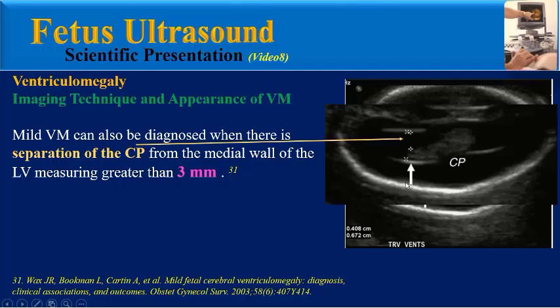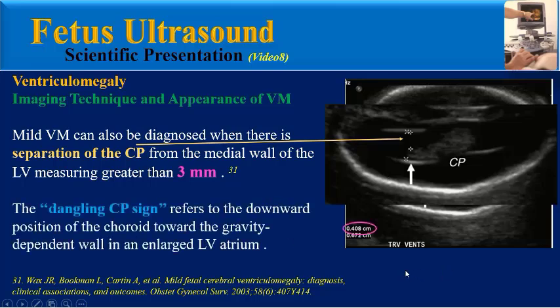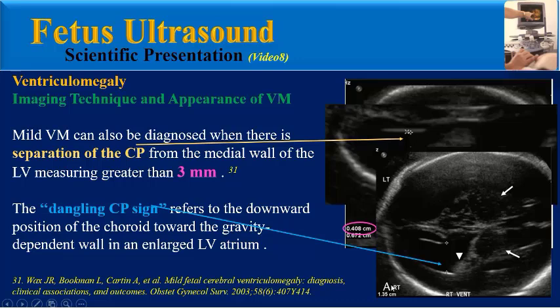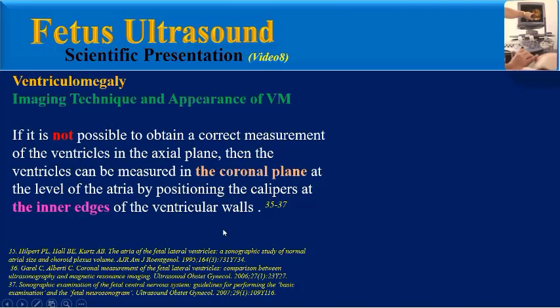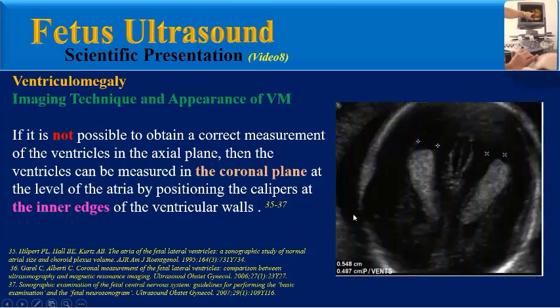To decrease possible technical deficiencies, the axial view should be strictly assessed by confirming that the proximal and distal calvarial margins are equidistant. Anterior landmarks include the cavum septi pellucidi, and posterior landmarks the fluid-filled V-shape of the ambient cistern. Ventriculomegaly can also be diagnosed when there is separation of the choroid plexus from the medial wall of the lateral ventricle measuring greater than 3 mm.